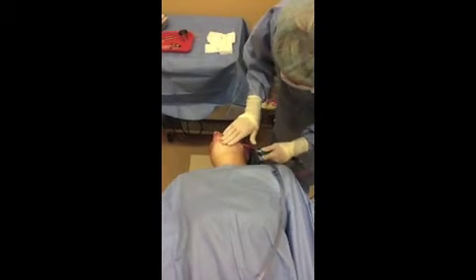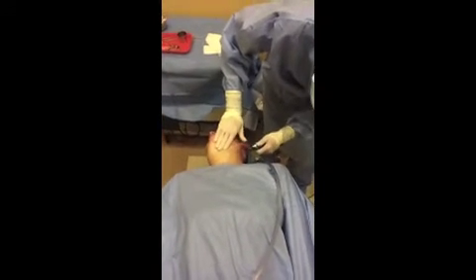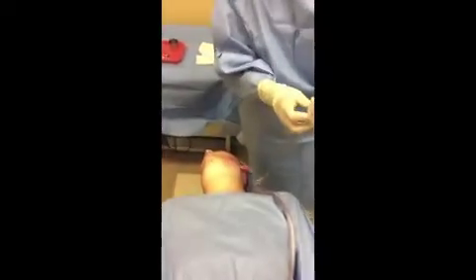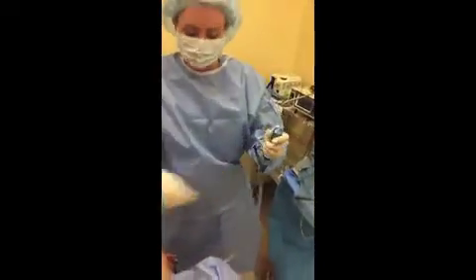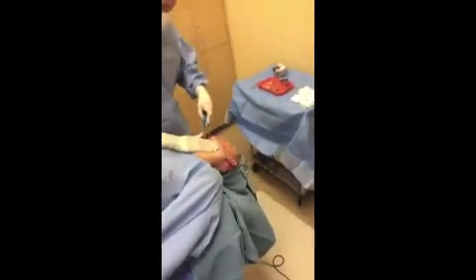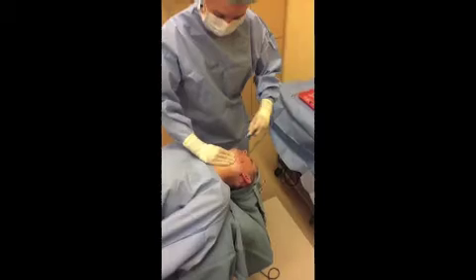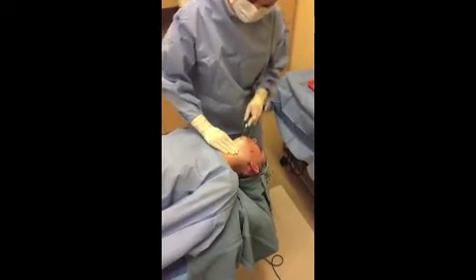This is my smart hand, making sure that I know where the cannula is at all times. Here you can zoom in on a cannula, showing that it's a little cannula with two little holes on the end where the fat, then it's attached to a suction tube. And the fat is sucked through the little hole there. Mary, go, oh, good. That was me checking for nerve function.